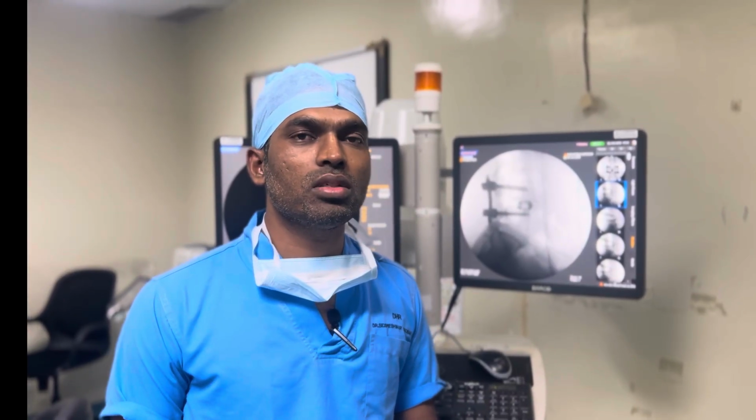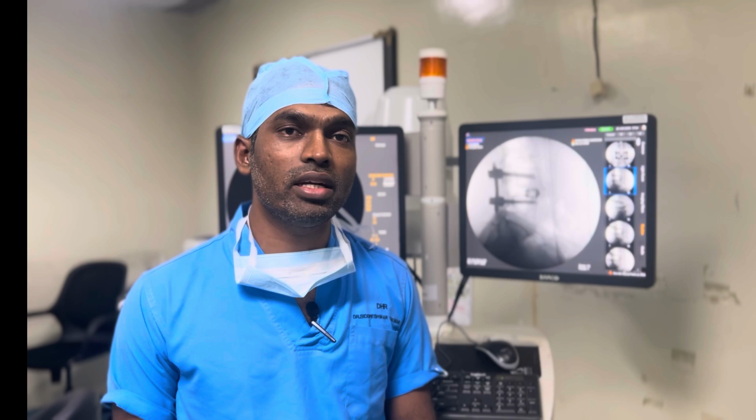In video it looks complicated, with so many shoots and guide wires and needles, but in practice it is very easy to do this. A single level TLIF can be finished with these percutaneous pedicle screws in 1.5 hours, skin to skin, and with this you can avoid a lot of dissection, a lot of blood loss and struggle while putting the open pedicle screws. It is very useful specifically when you are doing L5S1 lytic listhesis, where L5 is very deep seated and it is very difficult to find the entry for the L5 pedicle.